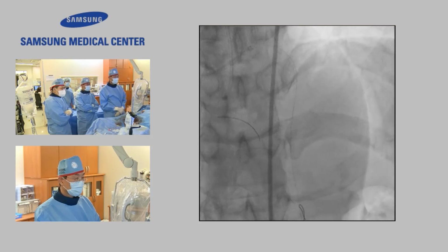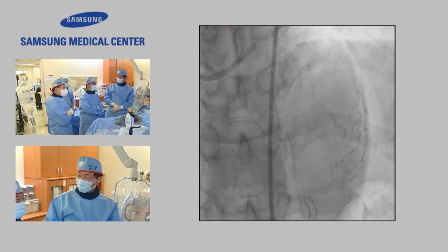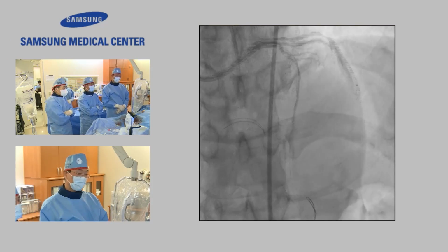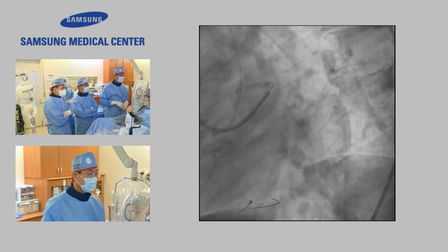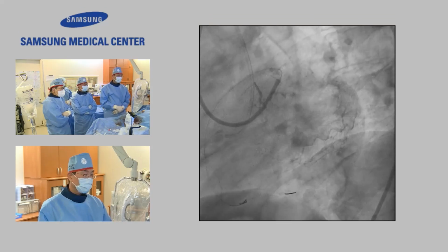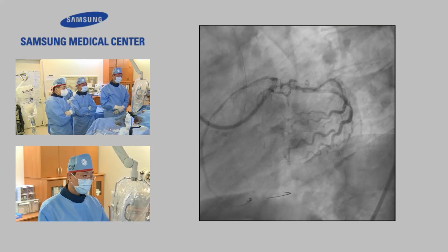Still, the diagonal proximal looks denser than before. Yeah, I believe so. I don't know why. There is a supply from the LAD. I don't know. Anyway, my intention was antegrade first, but we are waiting for 30 minutes. We have plenty of time.